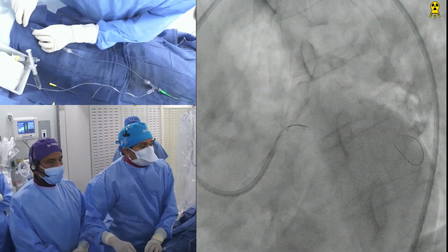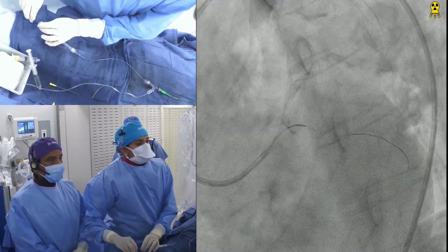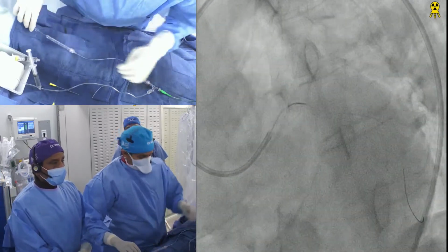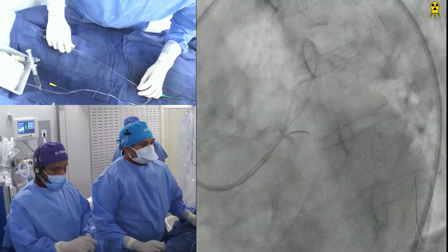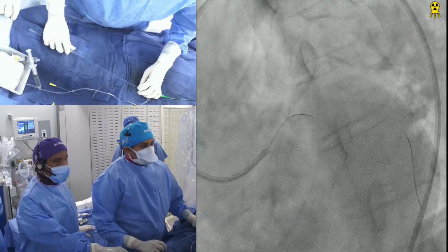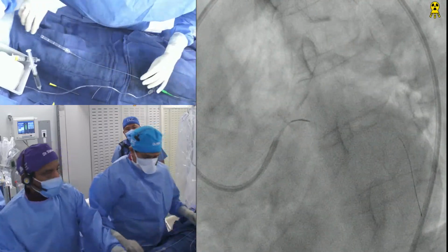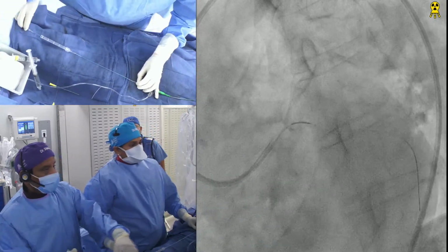Even if not, we can stabilize and bring out and put a smaller balloon, yeah. Right. But now it is the bigger wire, and now same torque it with the wire in the left side. First we undo it. Yeah, undo, remove all of it. So once you're across, you undo it now. Yeah, remove everything. Take a picture first or no? No, it's okay. Let me see.